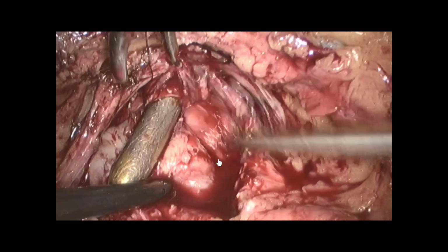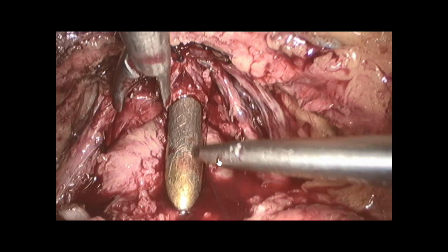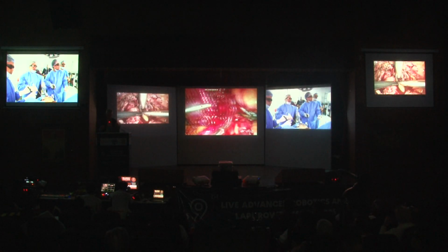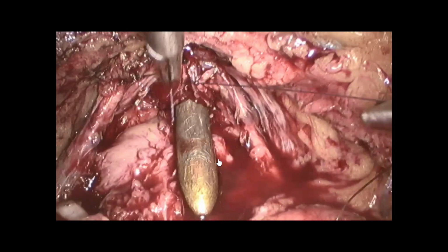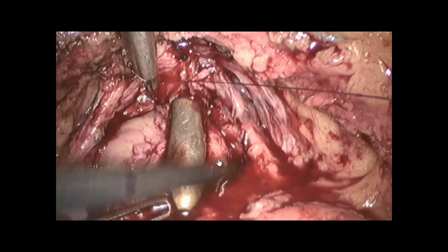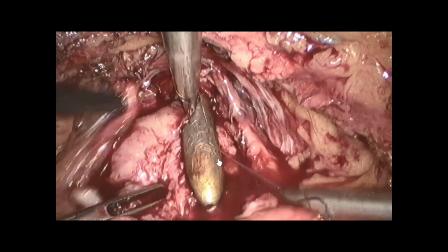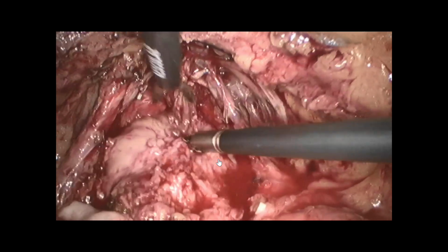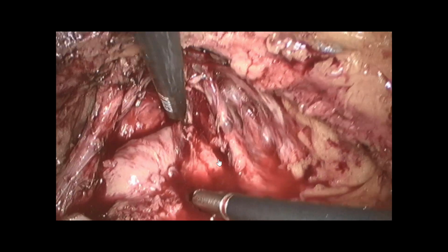And I fix them together, and it recreates an anterior part which will be solid. And for the time of the anastomosis, you won't have injury of the urethra, because sometimes when you have tension, when you place a needle, you can have rupture of the urethra. So you see that this part is totally fixed, and then at the end you have just to cut the end of the urethra, and normally everything is done.